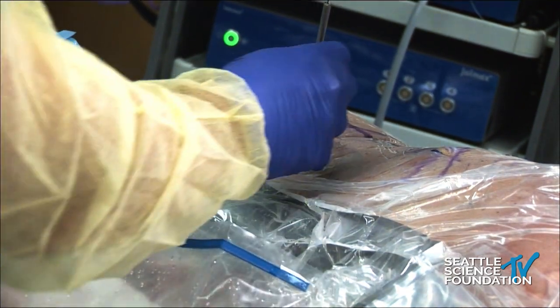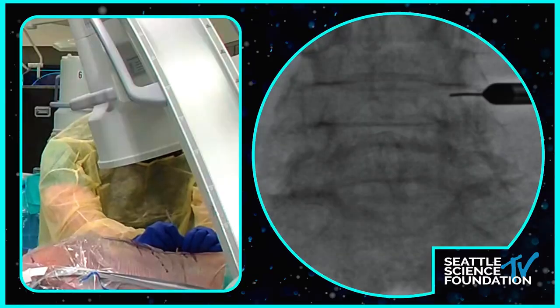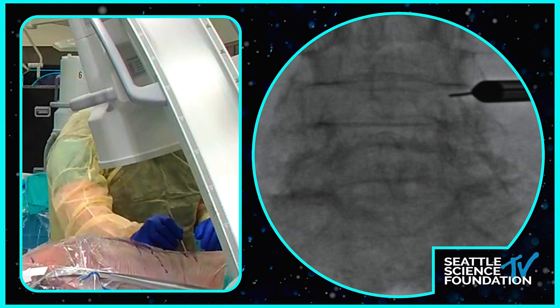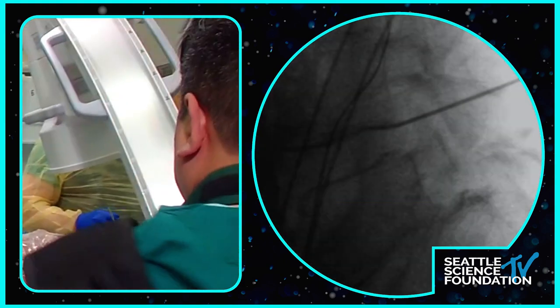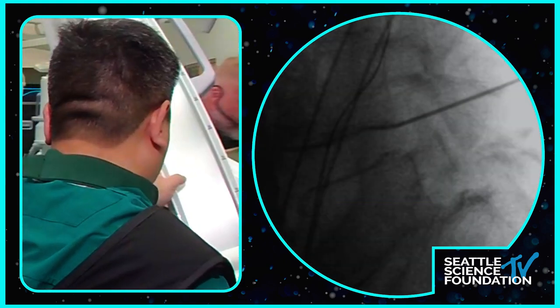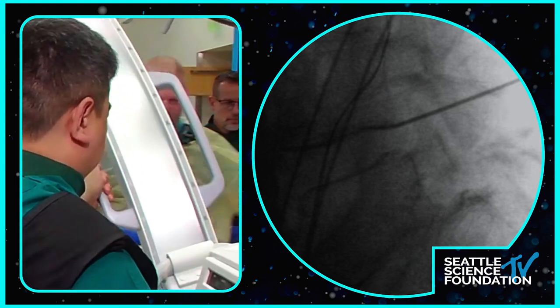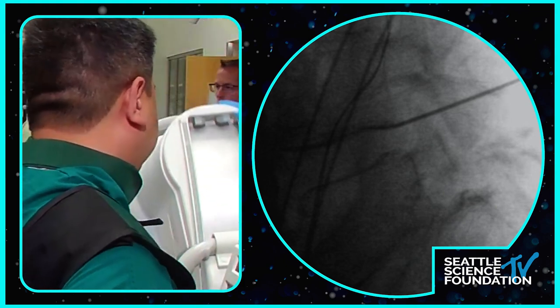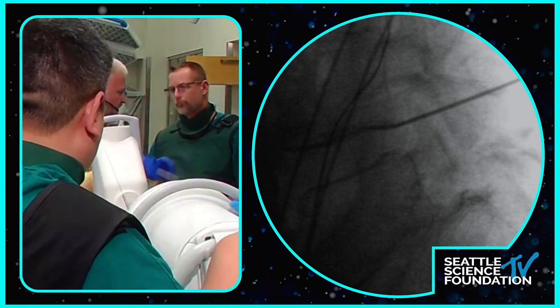Shot there. Pretty good. We're staying orthogonal to the disc space. I felt like I slipped past the pedicle or past the facet. Check a lateral. No, we're going to go with this cannula so I can just look around. We'll do that then. Do the foraminotomy, create the starting point.